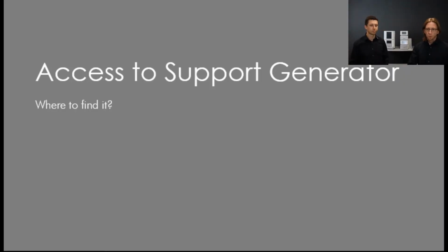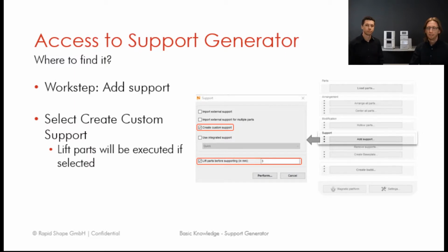All right, let me take over. So, the access to the support generator can be found in the machine environment of NetFab. Let me show you how to get there. So, first of all, this is something we already discussed a little bit in the previous webinars. One thing you already noted was the function add support. With this function add support, we used only the support script until now. So today we will talk about the option create custom support. So this is highlighted here in the picture, as you can see.